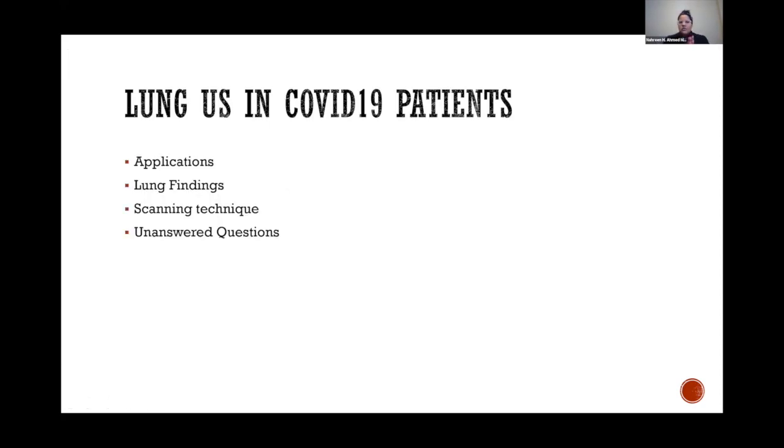So to shift over a little bit, how do we utilize all of these findings and what we know about COVID-19 patients? Just to give you a little bit of background about the types of patients we're seeing, I apologize about the sirens in the background.